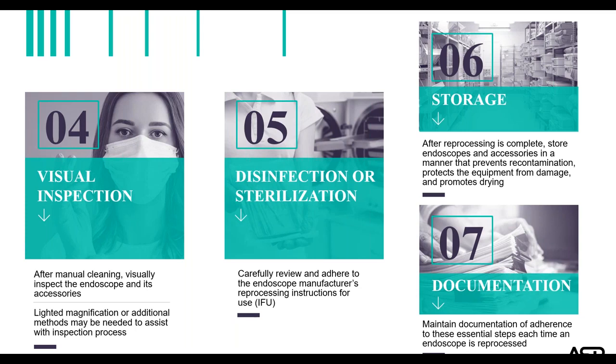And I just want to stop here because this is an area that I see some facilities having deficits in. And if you're using an AER, automatic endo reprocessor, you're going to have wall filters and you're going to have internal filters. Typically, I see the wall filters changed out by biomed or facilities, and they should be keeping a log on when those are changed out. But if they're not, then you should be keeping that log.